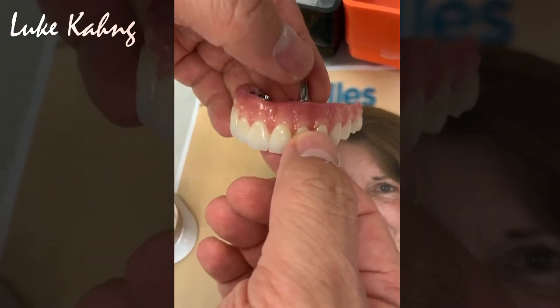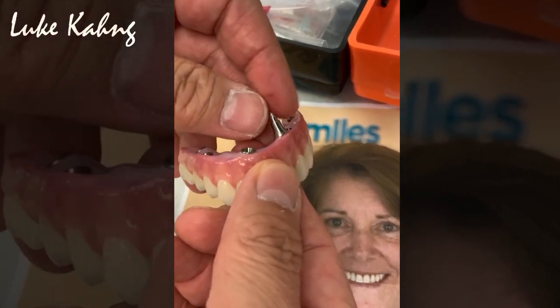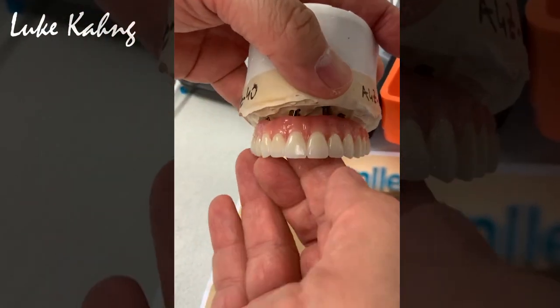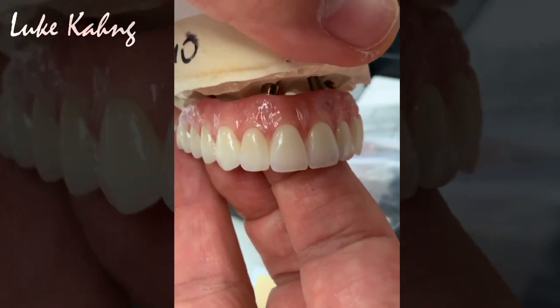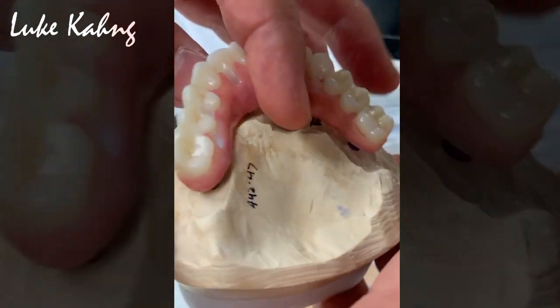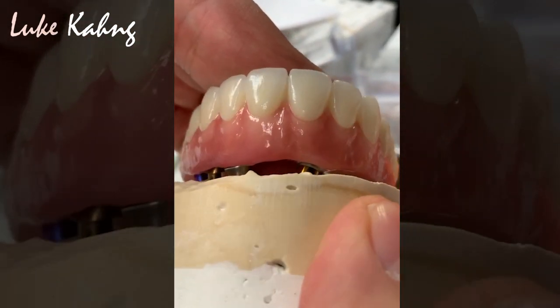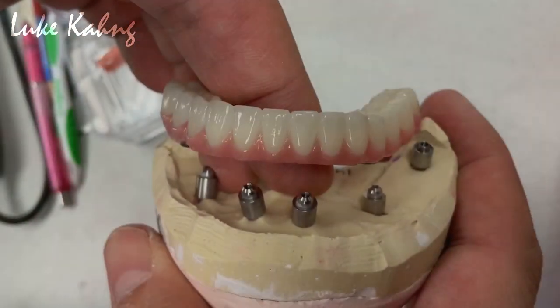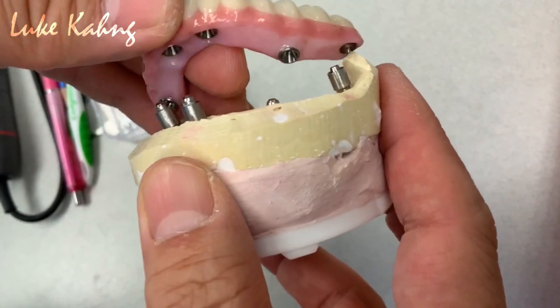This is a sleeve. I'm sorry, this is a temporary cement, but the other one is a screw-retained case because the implant site is a little bit tough. So this is the final we cemented. And the spectacular case is going on. Like this. Okay, sent to New York. There's another top case, a long span with 5 implants. You will carefully fit it.